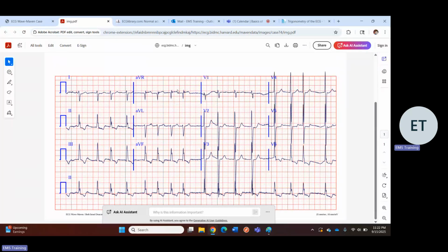There's some ST elevation in lead aVR. So this definitely looks kind of ischemic, huh? A little bit ischemic. I don't know. AFib with borderline RVR, some sort of non-specific conduction delay, maybe some sort of hemiblock or posterior fascicle type of thing. ST changes in non-specific areas.